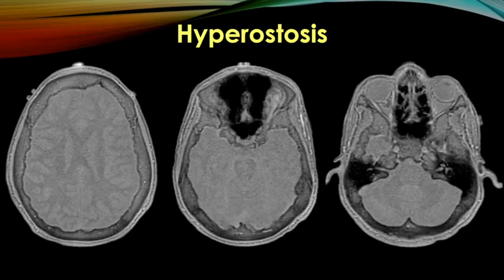This is an interesting case of a patient with chronic epilepsy who was scheduled for surgery, and we did a stealth MRI, including ZTE. So I just thought it was an interesting example of hyperostosis following anticonvulsant therapy. You can see quite a bit of bone stock in the calvarium, pneumosinus dilatans, and so forth. But again, a one-stop shop planning study.